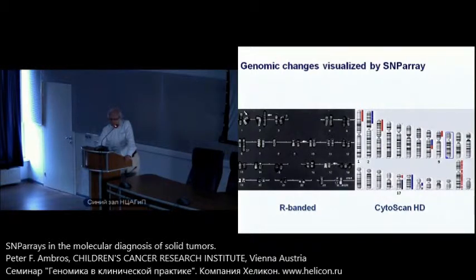This is a karyotype. I'm not sure you're used to it. This is R-banding, which we preferred these days because it preferentially identifies the tips, and the tips, you know, are most likely lost in tumor cells. You see something happening on chromosome 2.